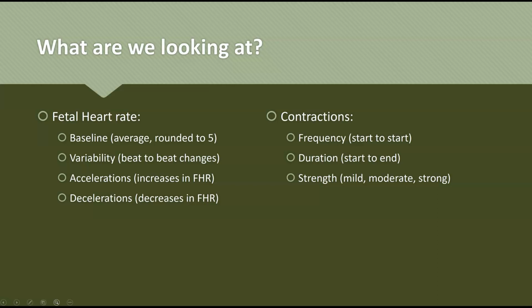We can run the risk of too many contractions too close together. Another important piece of assessing contractions is to assess for the resting tone in between contractions. We want mom to have a period of rest between contractions. Not only does that allow for rest of mom because contractions are stressful, we also want that relaxation for baby.